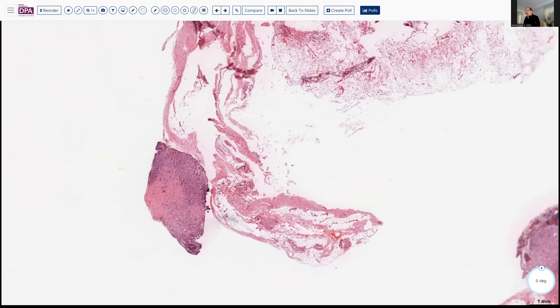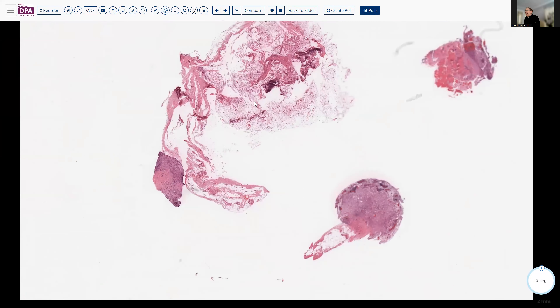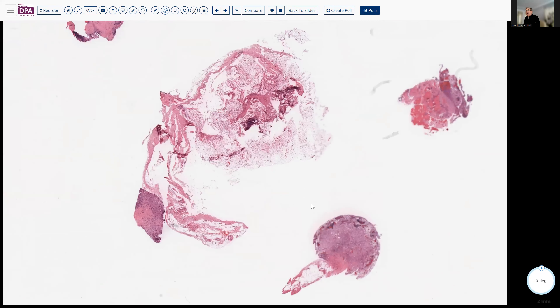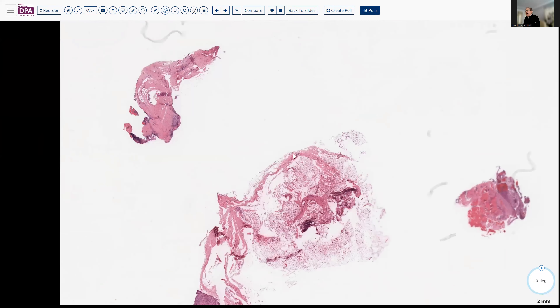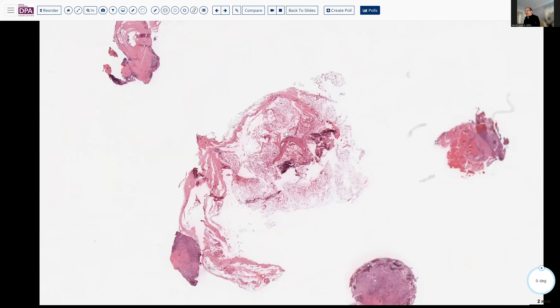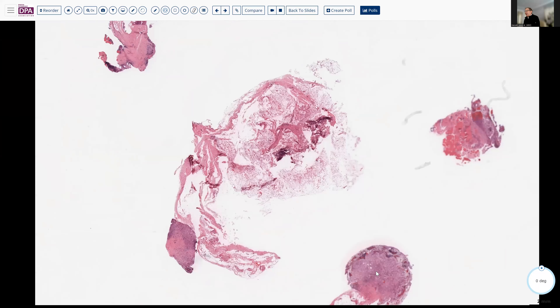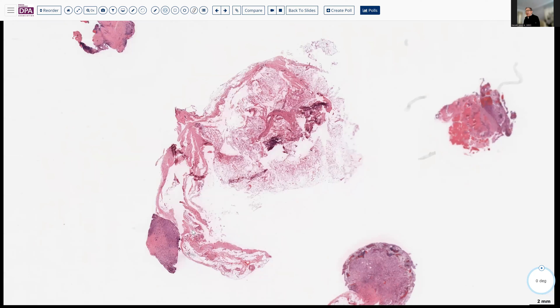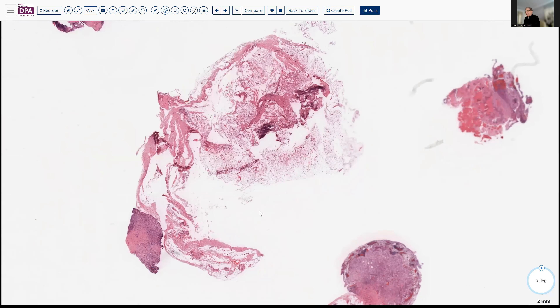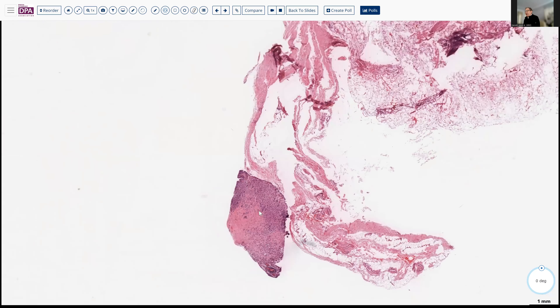In addition, a KI-67 stain was performed. That's an interesting choice, but it showed that, in fact, there was a very, very low proliferation rate in these cells — virtually no positivity in these suspect cells that we had been so concerned about on our initial biopsies.